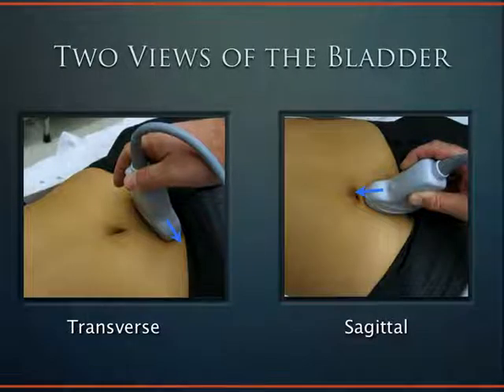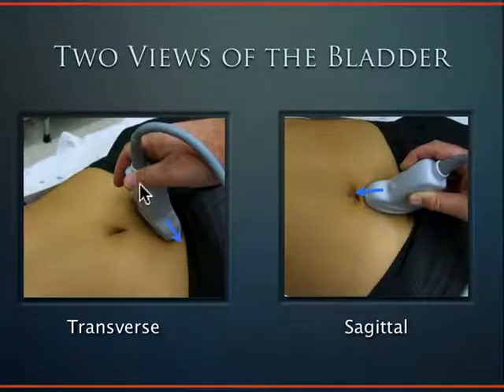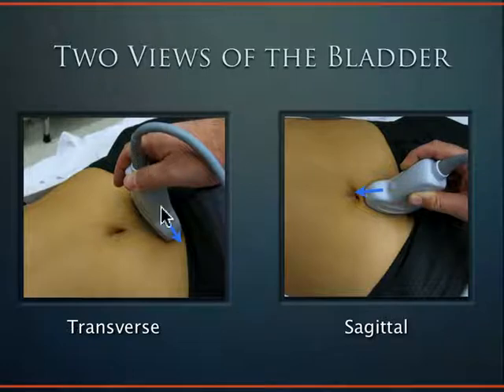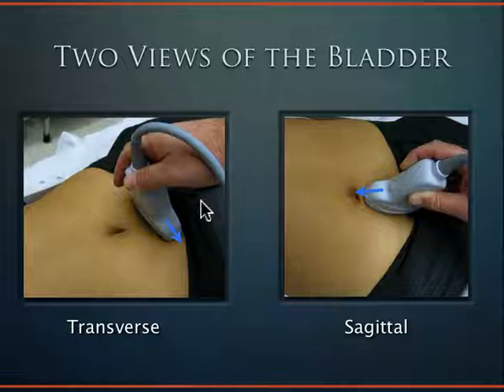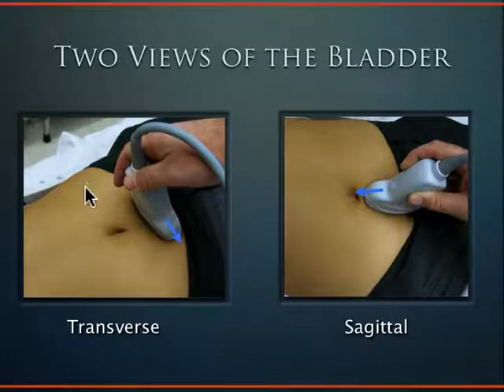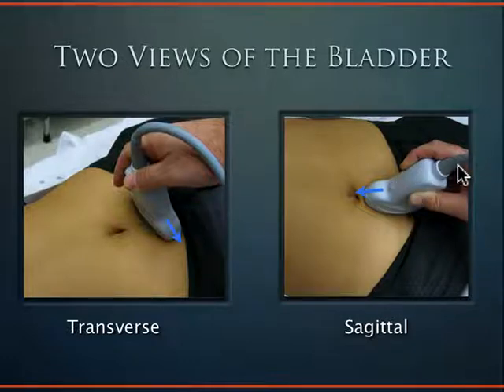There are two views of the bladder: the transverse view with indicator to the patient's right, and the sagittal view with indicator to the patient's head. The probe goes just below the umbilicus, but the bladder is actually down near the pubic symphysis. In clothed patients, you end up placing the probe a bit higher than the bladder, so to compensate you tilt the probe inferiorly — sending the sound down where the bladder actually is. Same in the sagittal view: rotate the cable to shine sound inferiorly.